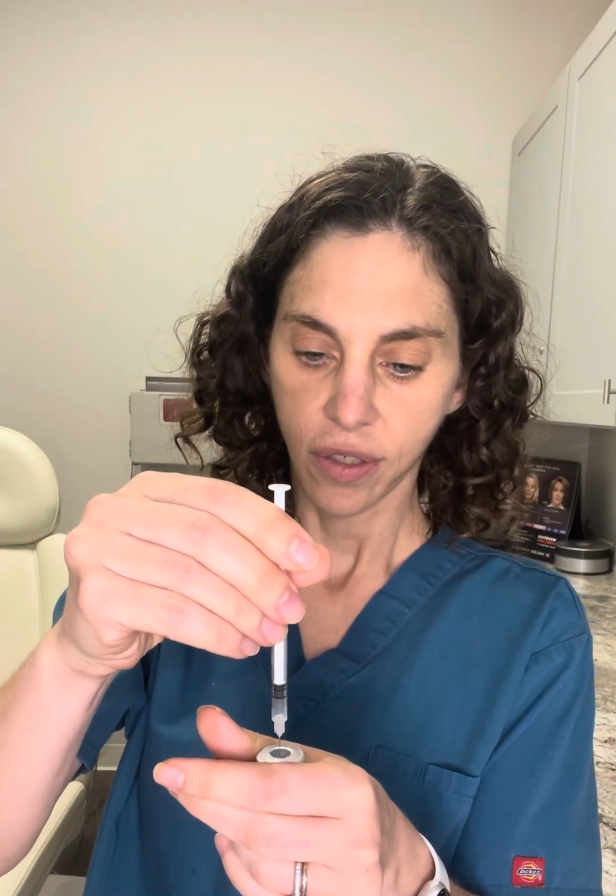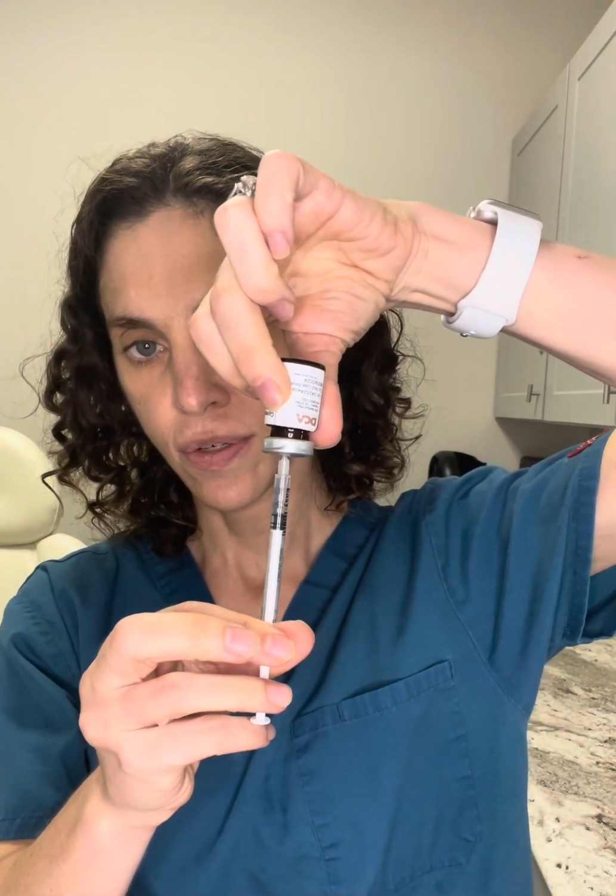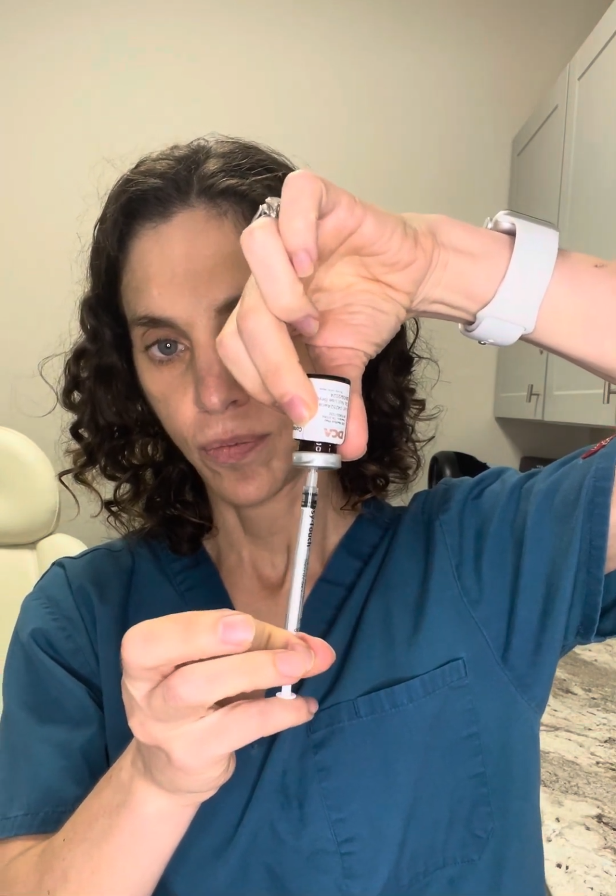So again, when you get your medication, you wash your hands, you get all your supplies ready, you take the cap off, you pull back, get a little bit of air in, typically around the amount that your dose is going to be. You have already cleaned the cap, and you inject, push the air in, flip the vial upside down, pull out. Here you have medication. For our purposes, I'm gonna put it right back in, but you will not. Whatever unit or medication amount that you were supposed to use, you pull that out.